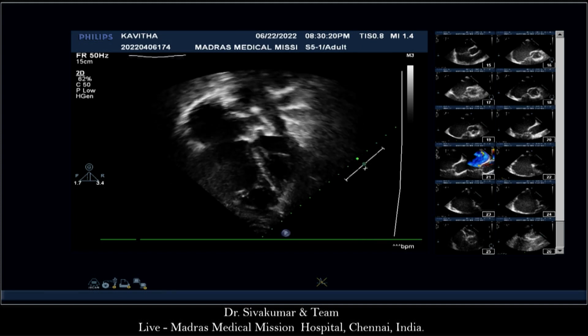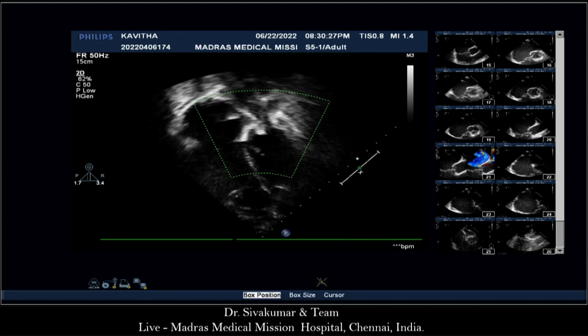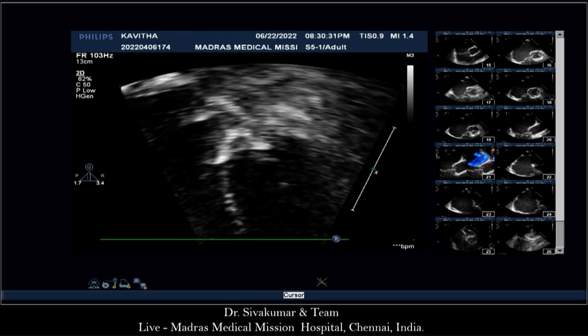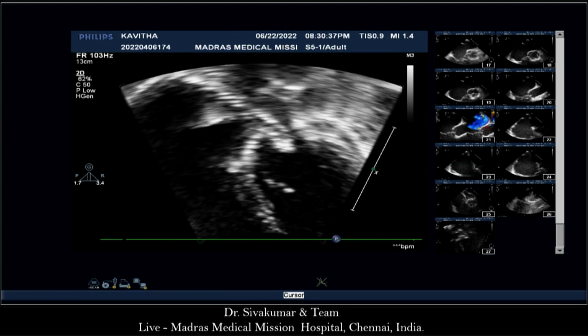I don't like this picture. Okay. I'm sorry, but it's too big for me. Yeah. This is a very big device. So we got to make sure you're not just looking at one area. There's a whole 29 millimeter, and half of that diameter is where the device is sitting. It's very important to look at it.